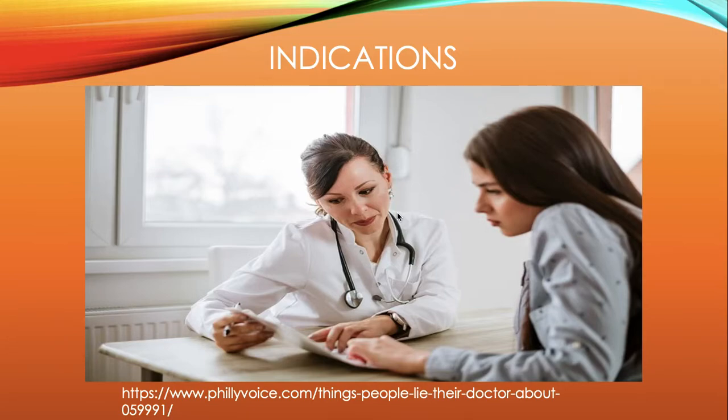Some indications could be a laparoscopic cholecystectomy, which is the removal of the gallbladder, and this comes with having jaundice or a history of jaundice, history of pancreatitis, particularly related to gallstone pancreatitis, elevated liver function tests, a common bile duct that is larger than 5 to 7 millimeters in diameter, a cystic duct larger than 3 millimeters in diameter, multiple small gallbladder stones, unclear anatomy, common bile duct stones visualized on preoperative ultrasound, possible bile duct injury or leak, and a short cystic duct. So IOC is an image of your bile ducts after removal of the gallbladder, like I said before, and these are indications as to why you would have one.